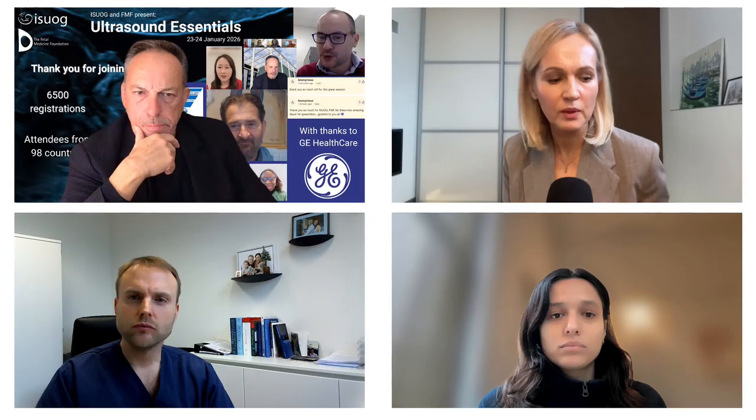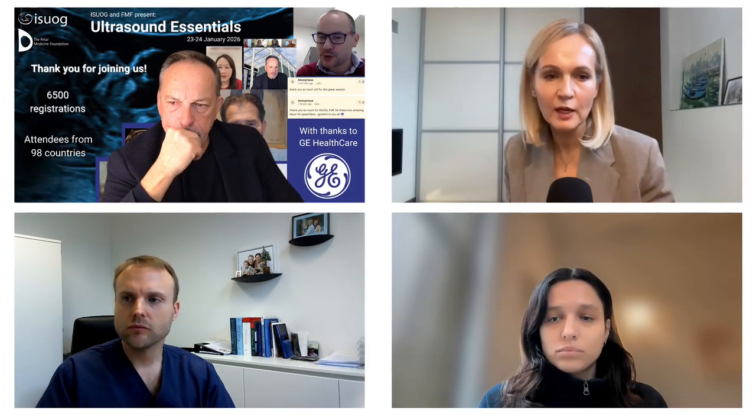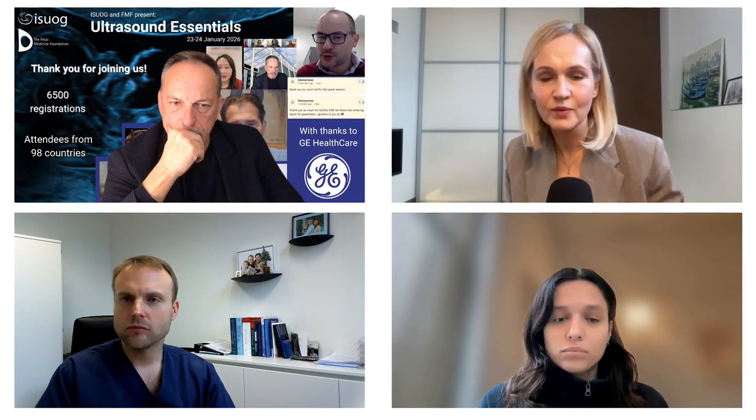Okay, I know that many people really rely on this tool and are waiting for it. Yes, but in the meantime, it's built in many ultrasound machines, so people can use the adnex model, but only the app is a medical device. But the model has been validated in over 100 studies globally. So we know that it's reliable and it can be used, but we cannot offer it.